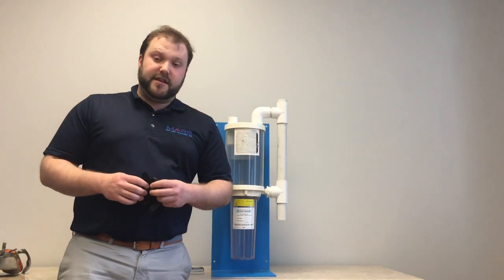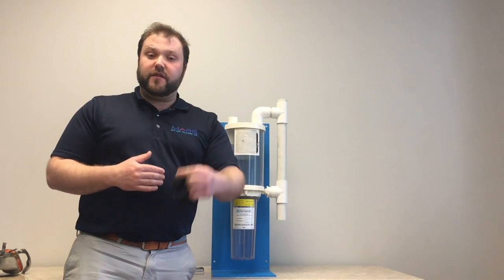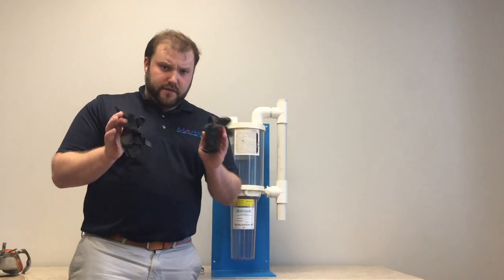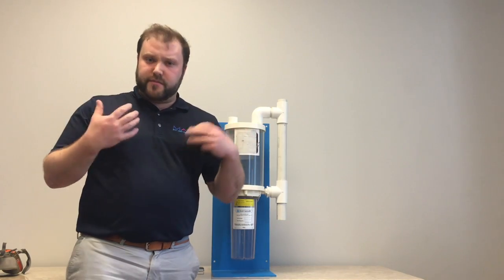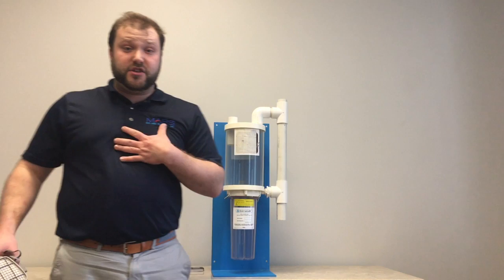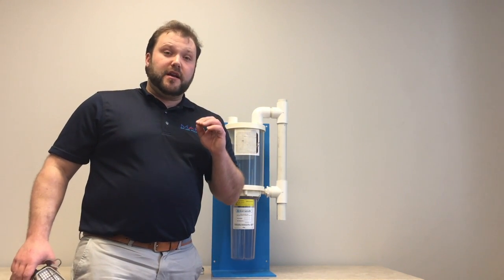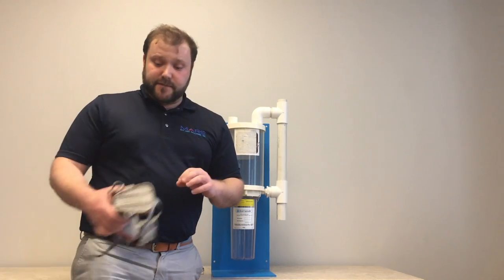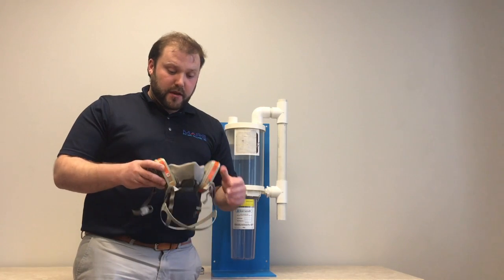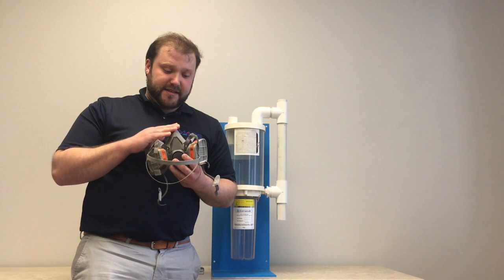What I'm going to suggest is the same procedure SolmeteX suggests when removing and filling or changing a SolmeteX filter yourselves. Wear gloves. They also suggest wearing a coat and some protective gear. The most important piece of protective gear that I suggest, and that every certified M.A.R.S amalgam separator specialist is taught to do when changing any amalgam separator, is to wear a respirator. This respirator is rated for mercurous gases.